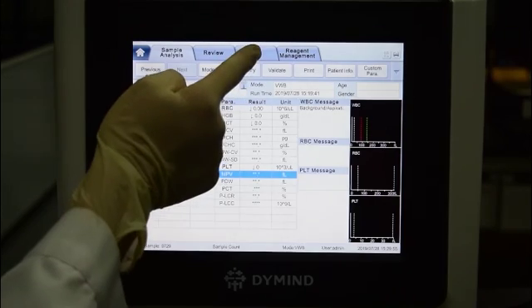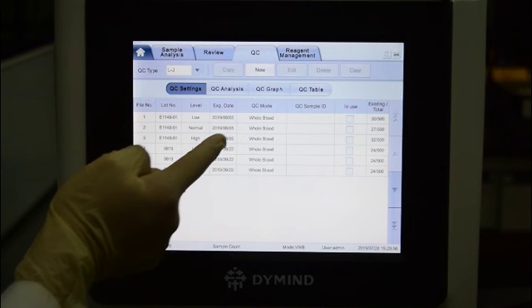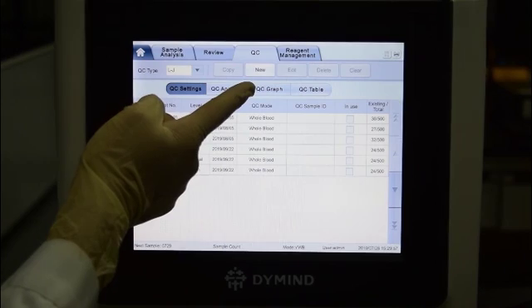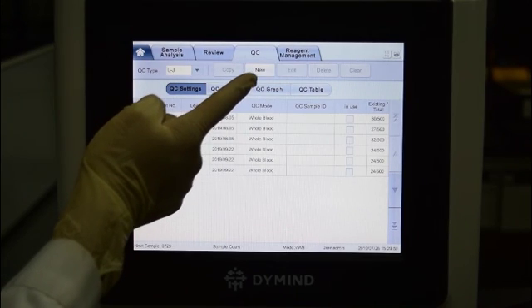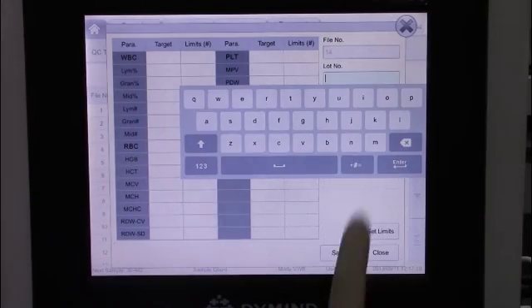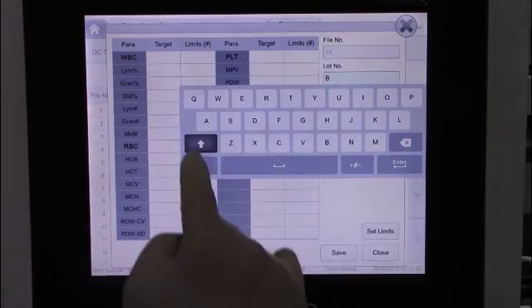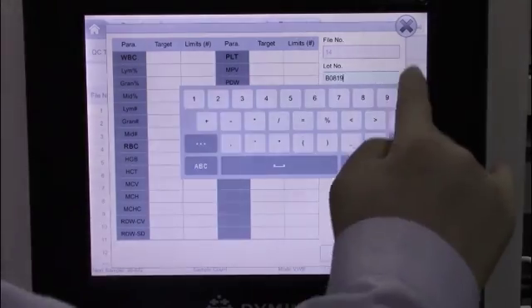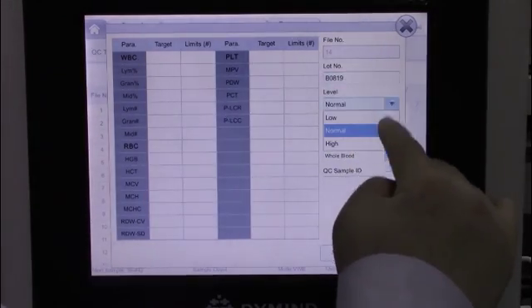Click QC interface and stay on the QC settings interface. Click the new button. Input lot number, expiration date, QC ID and choose the QC level.